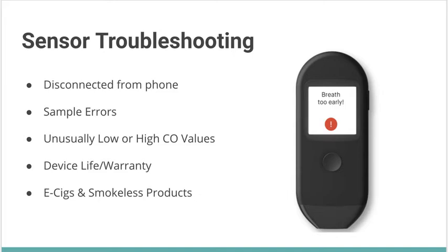Now, the device life is 18 months. After that, we would need to send the user a new sensor if they were still participating in the program. Now, e-cigs or smokeless tobacco products are not intended for this sensor. It will not actually provide a CO reading and does not affect the measure in the exhaled breath.